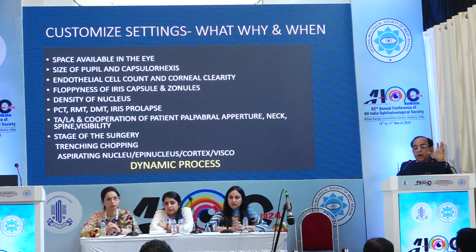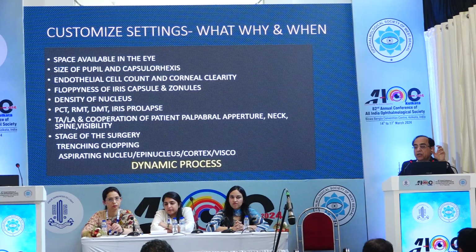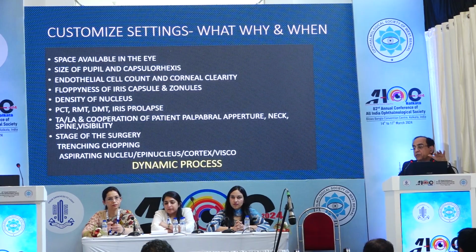So power setting is a dynamic process depending upon each individual patient overall.